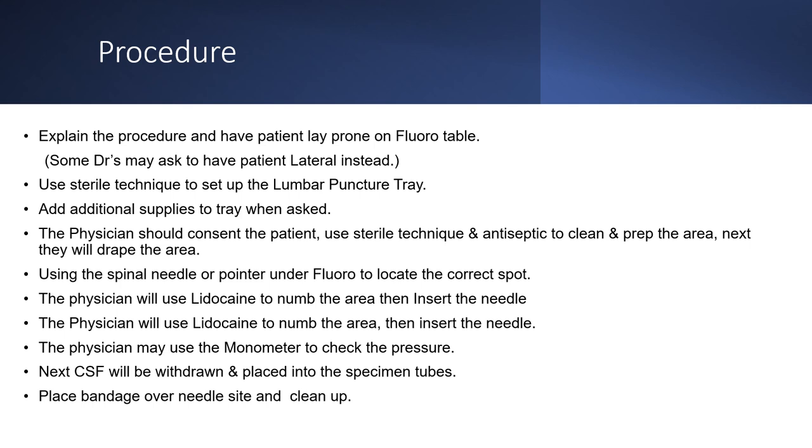Some tests require like 20 drops and some require 10 drops. So you usually try to fill at least three of those tubes out of the four. Sometimes they really try for four, but I know for sure they always try to fill three at least. You take everything out, clean up, and place a bandage over the site.